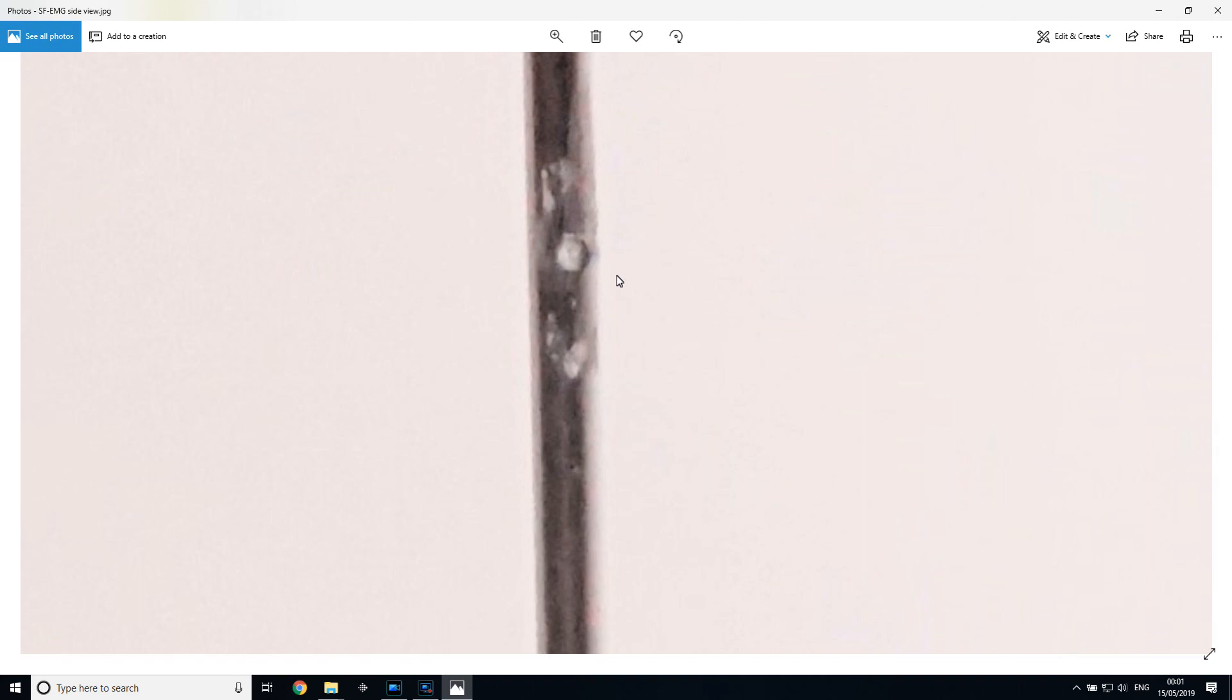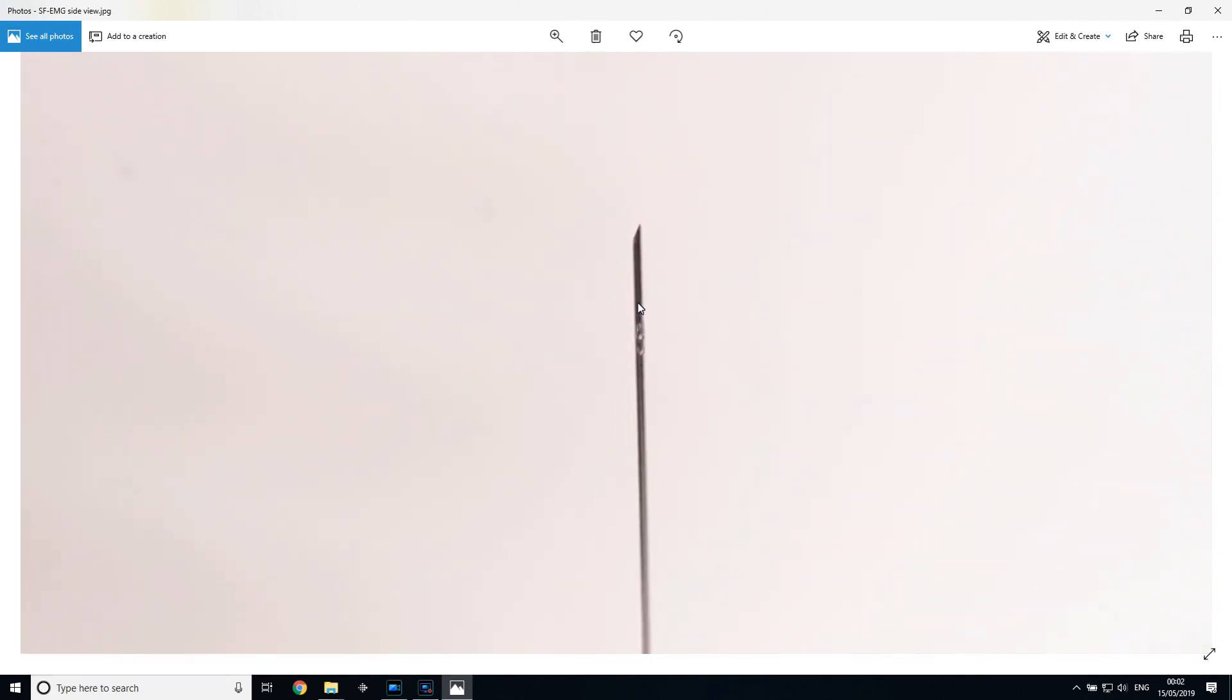Which is approximately the same or even smaller than some of the muscle fibers that it will be recording from. So this is a really remarkable feat of engineering, and hats off of course to Erik Stålberg for inventing this in the first place. It's really quite something to consider and think about.